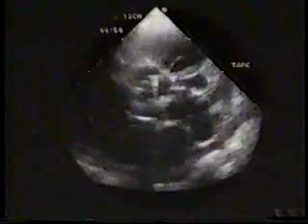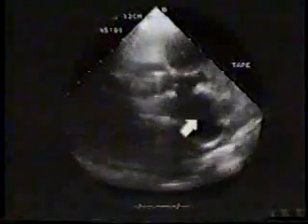This is a parasternal short-axis view of the prosthesis and left atrium. This is the atrial appendage. This cavity adjacent to the prosthesis is a pseudoaneurysm, which communicates with the aortic root and is lined only by adventitia. This is an expanded view.